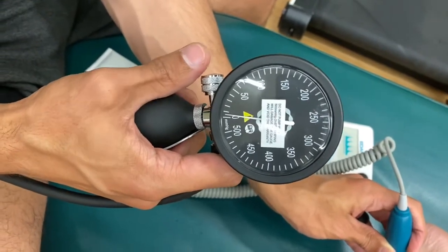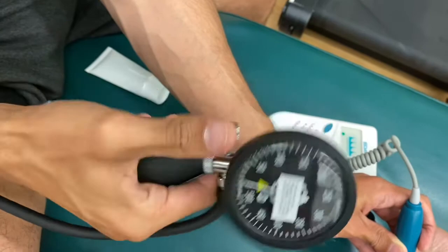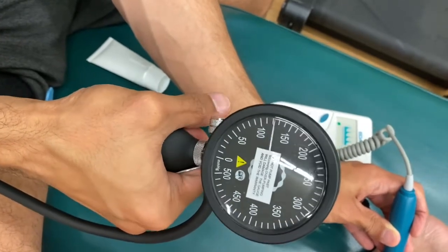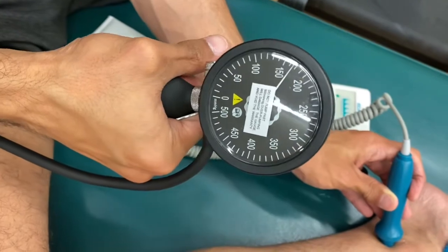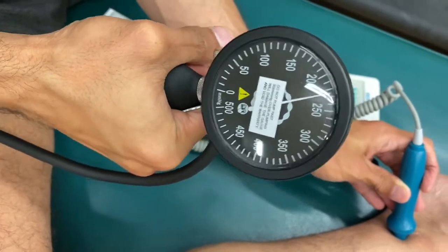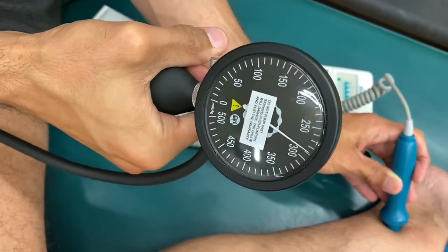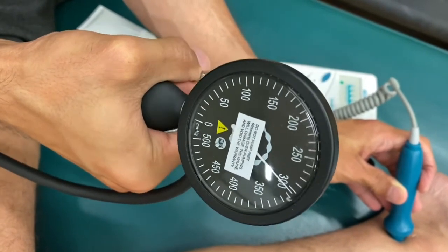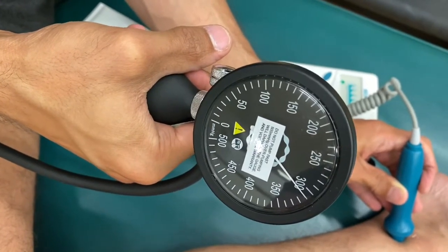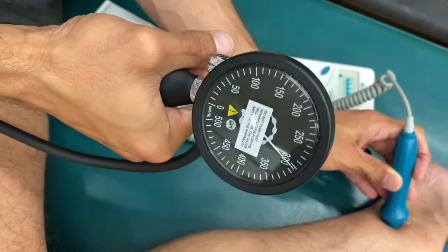Okay, so we're going to go very slowly. We're going to go 10 millimeters of mercury at a time. That'll allow us to really determine where that point is. And I'm going to tighten that first. You're going to start to hear those sounds petering out. Barely anything left. Just a little bit more. And I would say all the sounds are gone at around 310. If we let it just naturally fall a little bit, when it gets to around 300, we start to hear those noises again. So 310 is going to be the number.